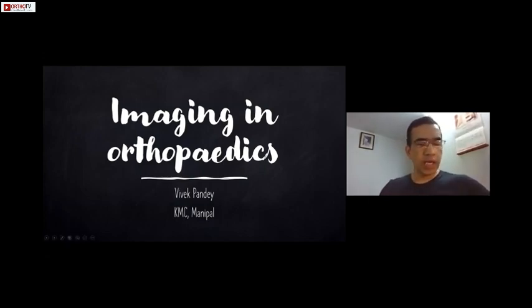Now, in the era when everybody drops into the OPD throwing the MRI in your face saying my MRI is done, it is often possible that people miss the X-rays. They think once the MRI is done, the X-rays or CT scan may not be required. No, that's not true. Yes, MRI is helpful to diagnose quite a lot of conditions, but those conditions can be very simply diagnosed with the help of a simple shoulder X-ray. You don't actually need the MRI to diagnose that.